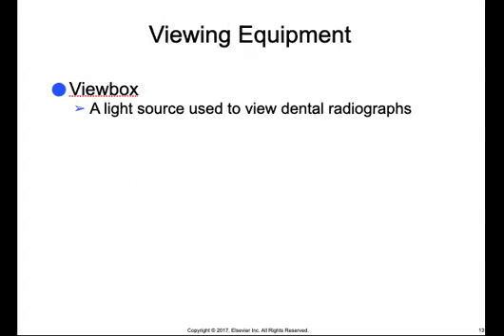So for the viewing equipment, a view box is basically just a light source used to view dental radiographs. With this type of equipment, we'll also want to clean it regularly. The plexiglass on the view box should be wiped and cleaned daily. And it should reflect a uniform and subdued light. If it doesn't, then the bulbs or the plexiglass might need to be replaced. Also, scratched plexiglass or dim bulbs will make the radiographs hard to read. So if that's the case, they should also be changed.